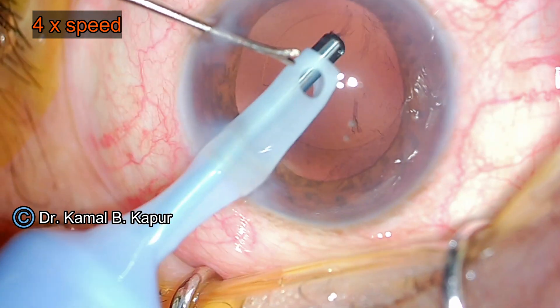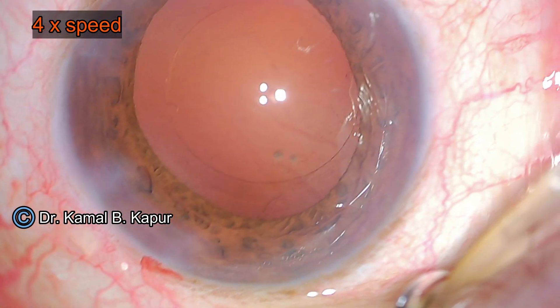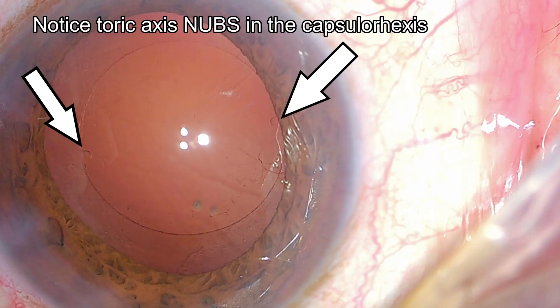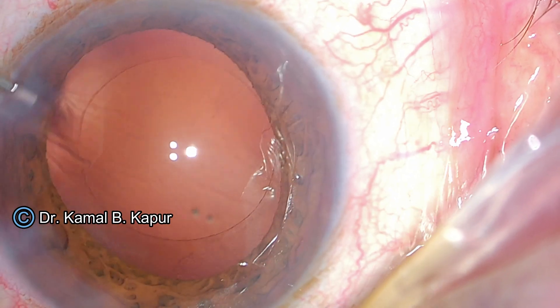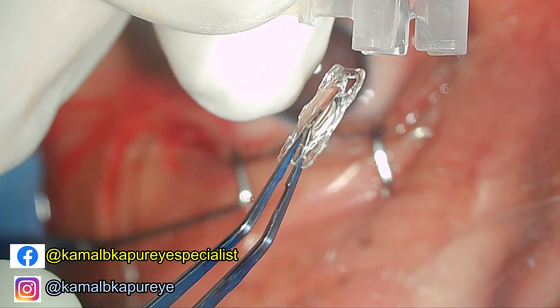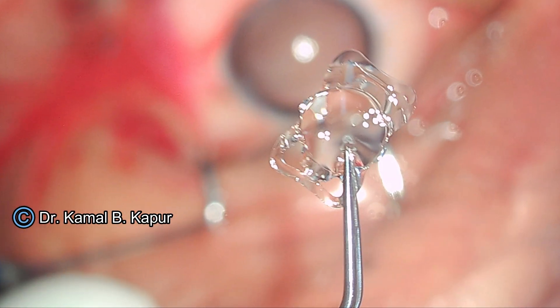You will see here that I am removing the cortex — the final cortex after a successful femtolaser cataract surgery. Now you will see the IntelliAxis, which is a proprietary mark of the Lenzar machine, where it creates two marking nubs on the exact axis where the IOL has to be placed onto the capsular axis, which makes the placement of the toric IOL very, very easy.